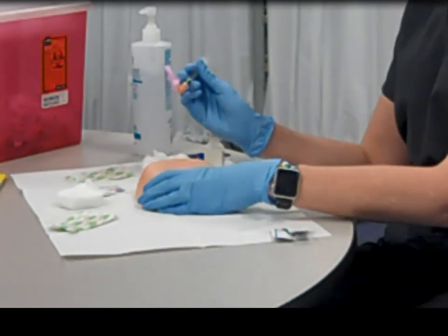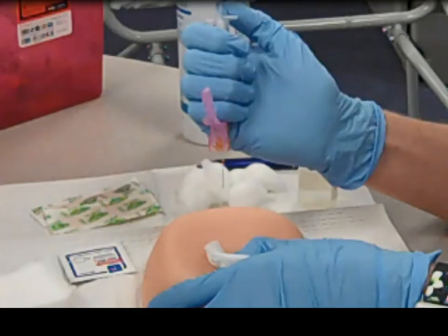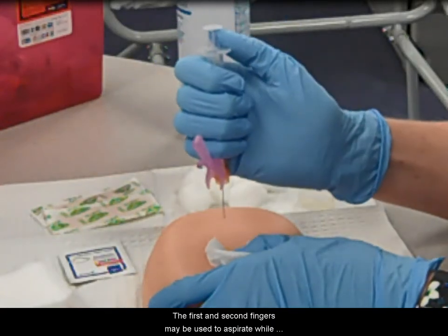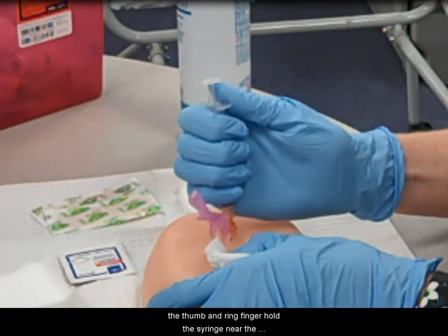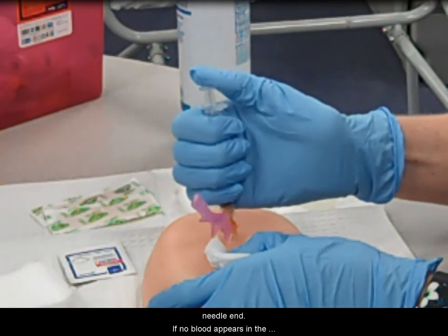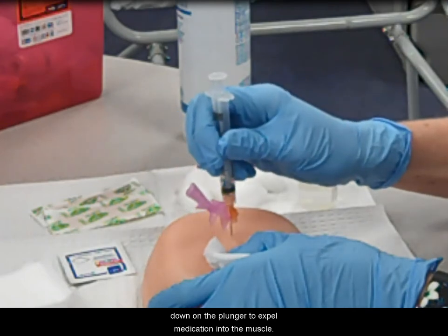Insert the needle at a 90-degree angle with a steady penetration. The first and second fingers may be used to aspirate while the thumb and ring finger hold the syringe near the needle end. If no blood appears in the syringe, proceed by slowly pushing down on the plunger to expel medication into the muscle.